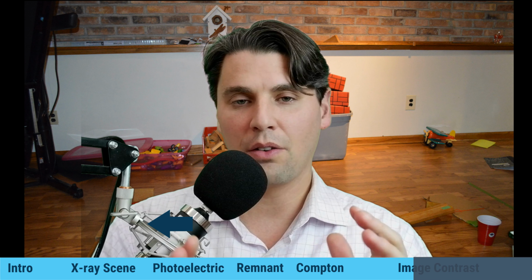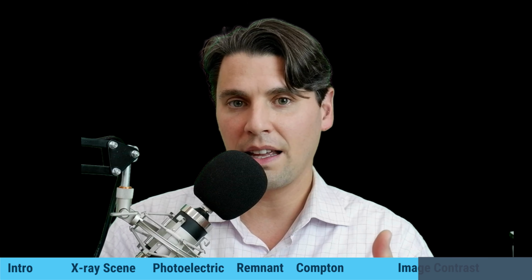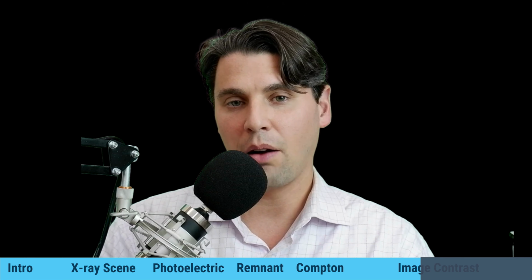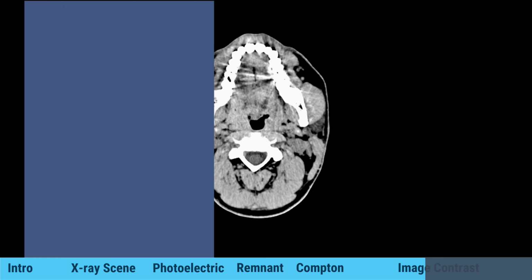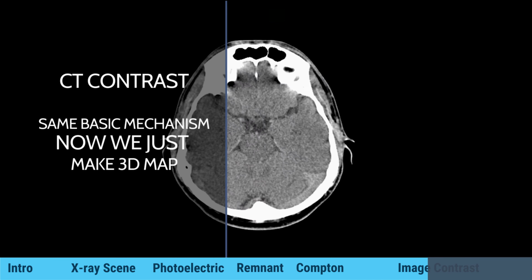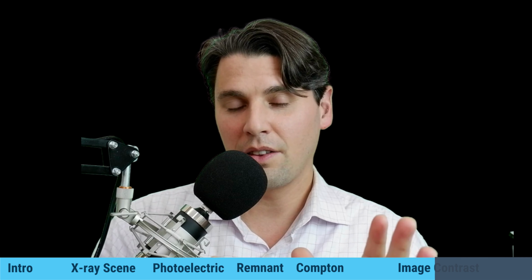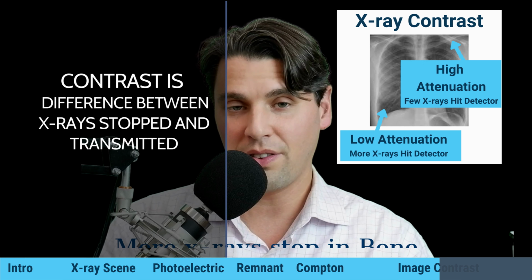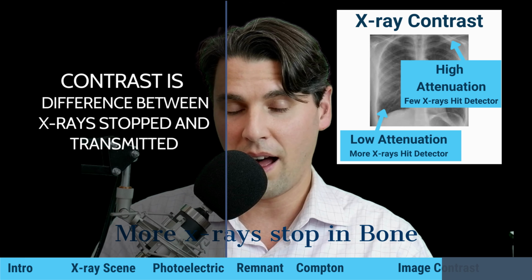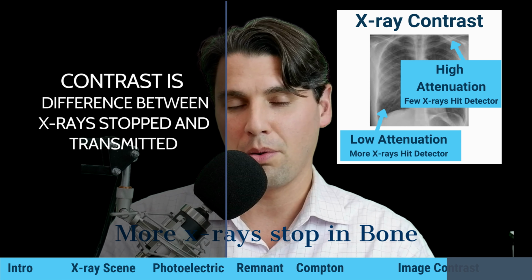So this is why the contrast is very good in X-ray images for bone or for iodinated contrast, things like that, which have high Z and which are likely to have a large percentage of interactions via the photoelectric effect. That's the general idea: contrast in your image is just the difference between those X-rays which stop and deposit their energy locally, and the X-rays which travel all the way through.